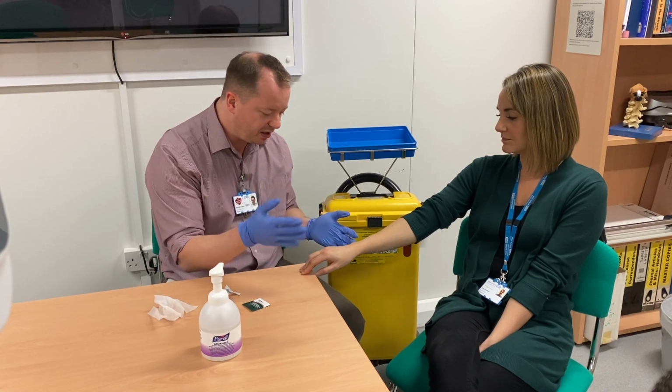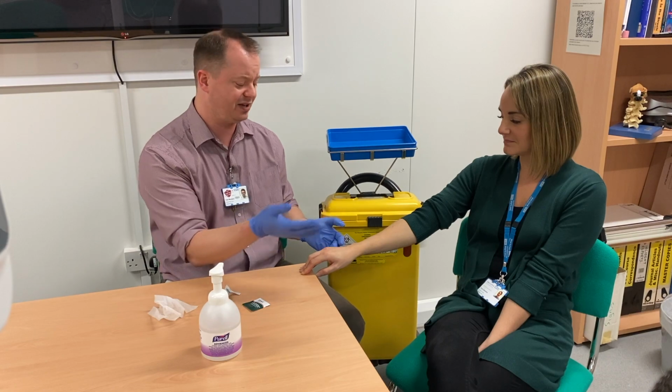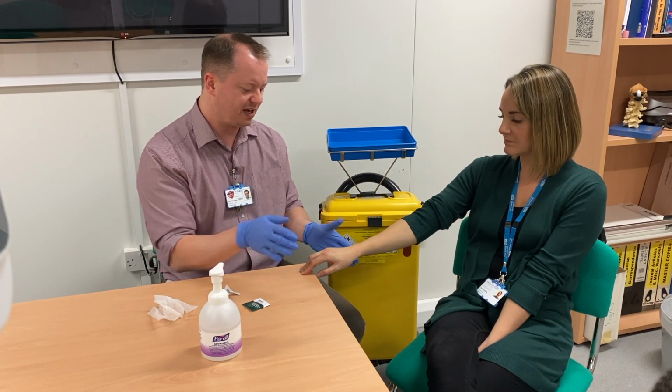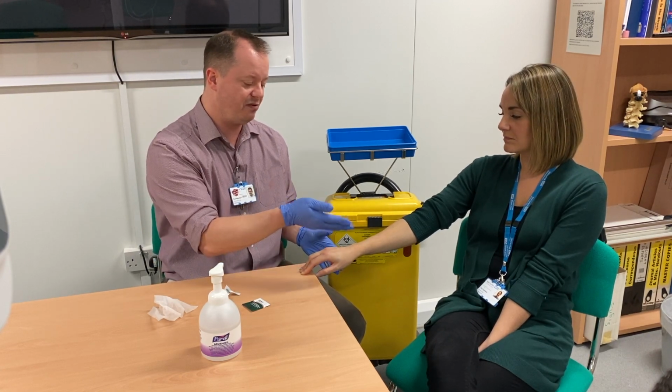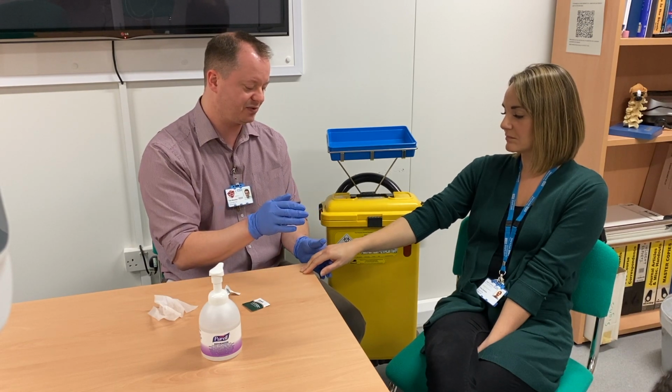Don't blow on the alcohol, just let it dry, and it should dry relatively quickly because your patient's warm, so it should evaporate and dry really quickly. Once you've cleaned it though, you can't touch the site anymore, and you can only touch the site with something that is sterile. So once it's cleaned, that's all done.